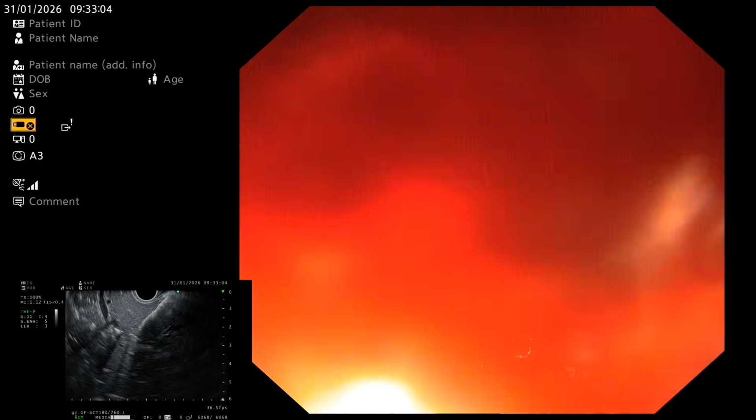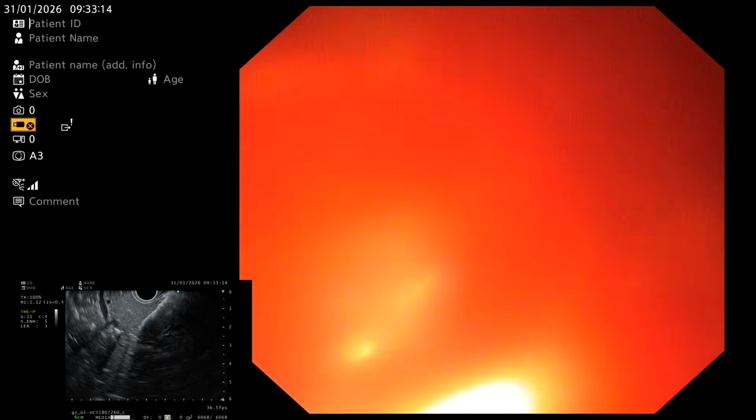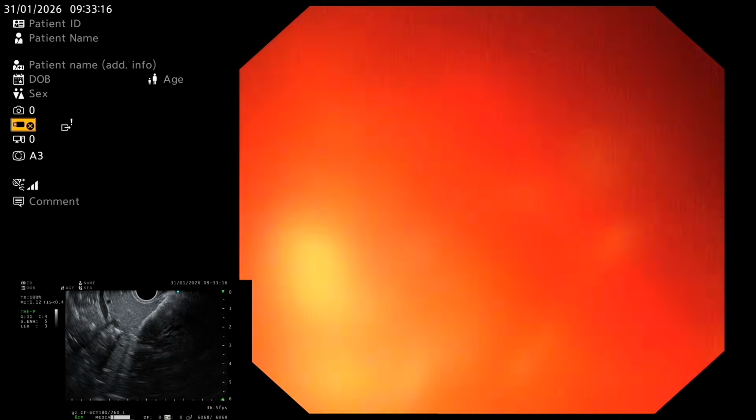CO2, please. CO2 is on or no? Ok. Je suis en train d'insuffler pour moi. Ok. X-ray.